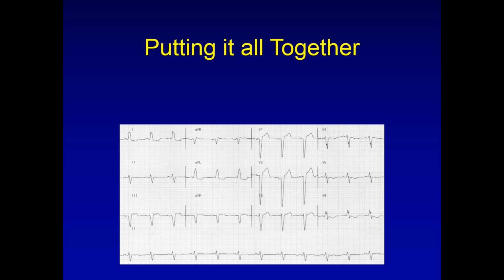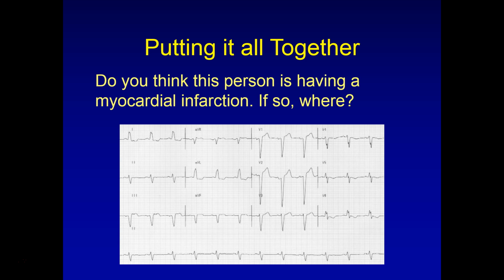Okay, let's put it all together. Take a look at the EKG. See if you can spot whether or not this patient's having an acute MI. And if so, can you locate where?